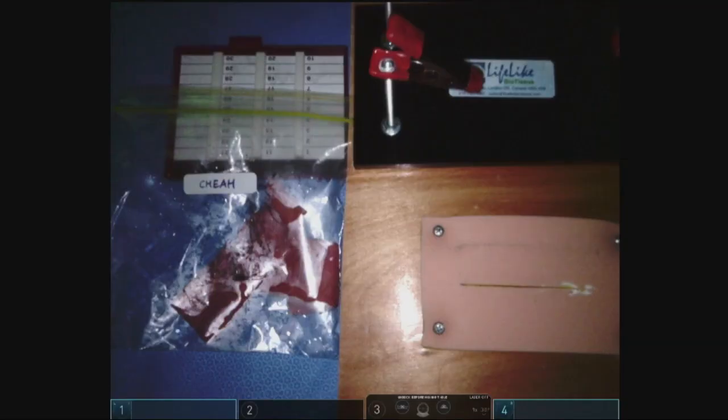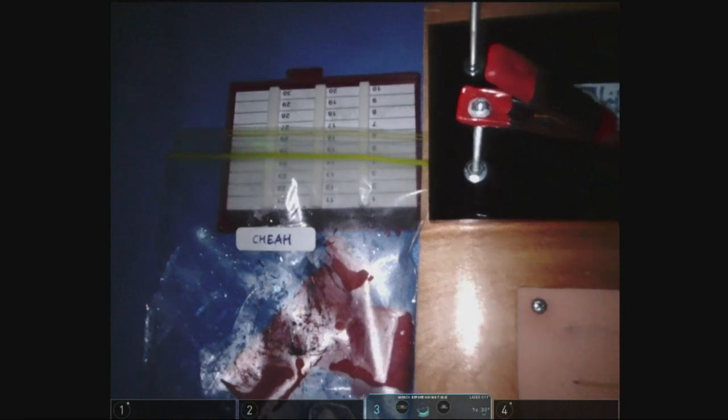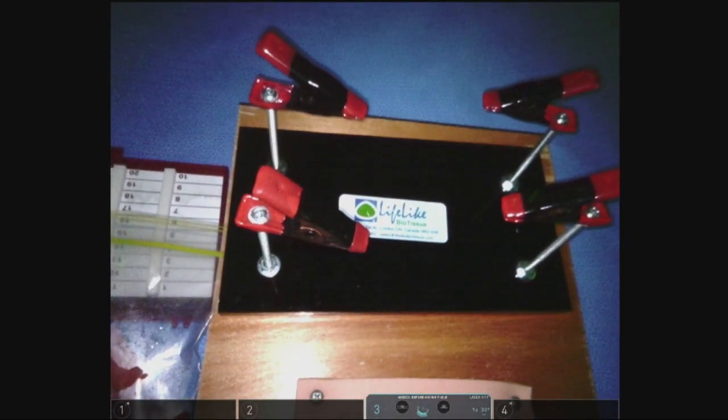You'll be given a Ziploc bag with your name attached to it, a needle box, a skin model, and a stand for your bowel. Let's look at the Ziploc bag first.